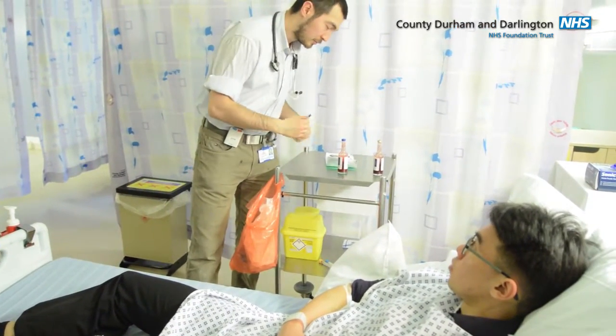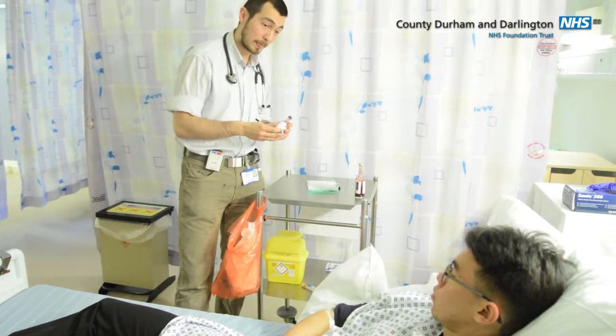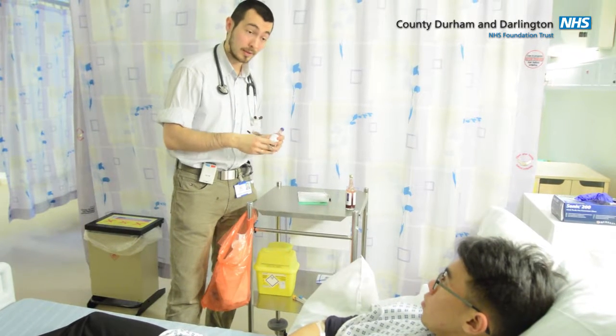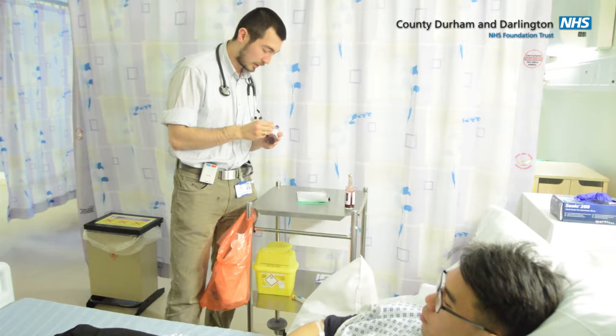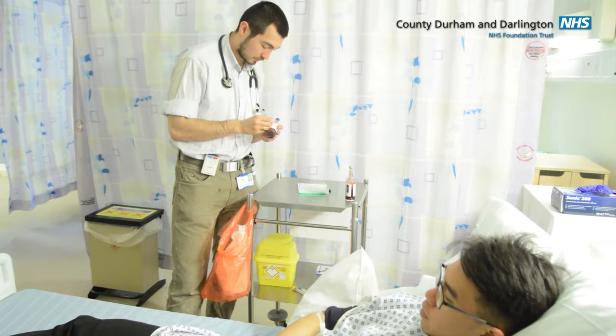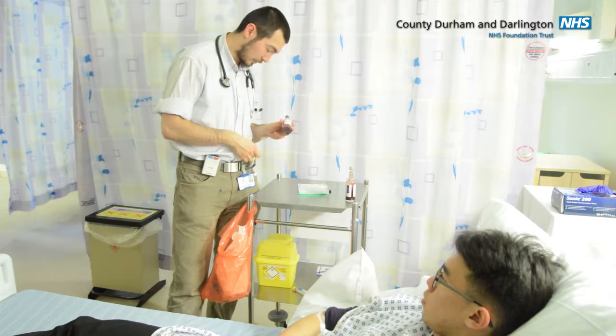So I just need to label these bottles, and what will happen is we'll send them off to the lab, and hopefully we'll have a result, a bug which is causing a symptom, grown as soon as possible. Can you just confirm your full name and date of birth for me as well? So my name is Louis and my date of birth is the 1st of January 1966. Thank you, Mr. Lowe. Time is 11:30.